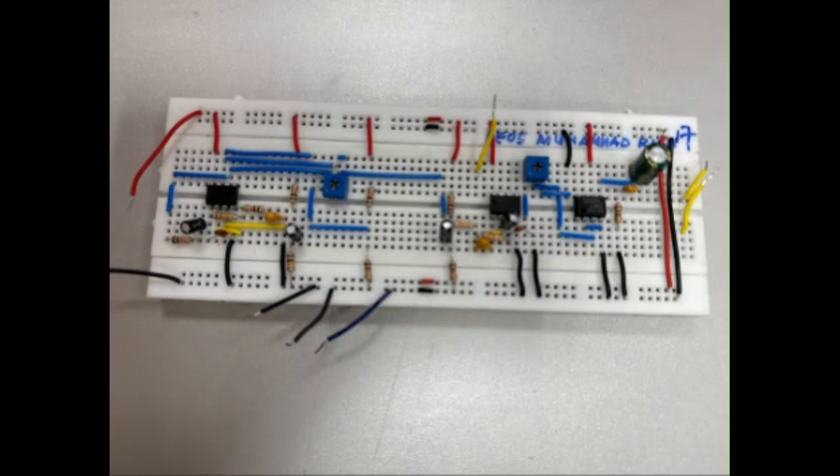So first things first, I want to show you my circuit. Its main purpose is to amplify biosignals so that they can be readable and measured for medical procedures to happen. Biosignals are normally too small for the human eye or ear to sense, which is why they need to be amplified. My circuit specifically boosts heartbeat audio from the stethoscope acoustic output and processes it to the speaker, which will output an amplified version of the heartbeat.